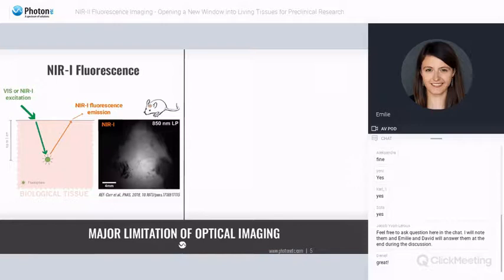Again, if you do some imaging, for example, here we have an image of a mouse that had an ICG injection, and we're looking through the skull. This was done by the Bawendi group at MIT. When they collect light coming back from the animal and look at 850 nanometers, we can see in the near infrared that we can vaguely distinguish some of the vessels, but we still cannot see very clearly the microvasculature, which is again a big limitation for small animal imaging.